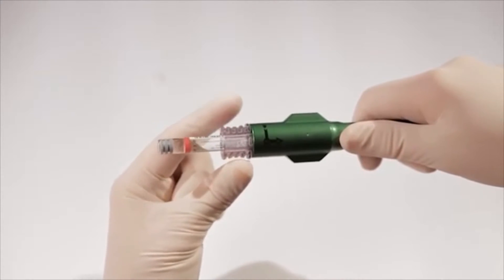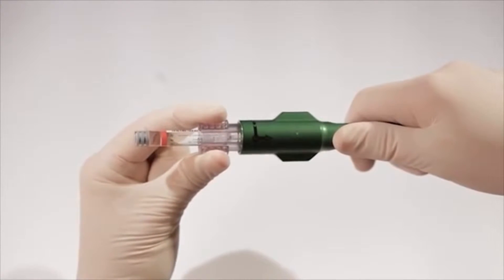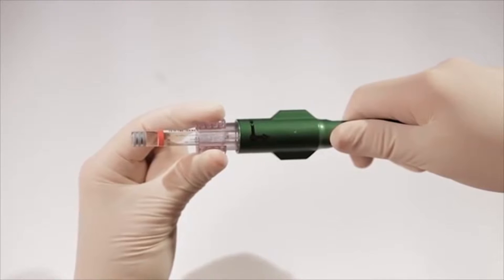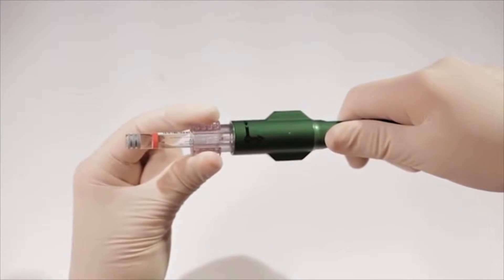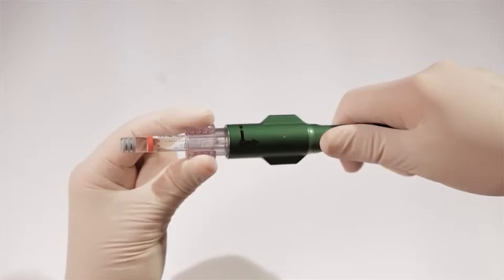To remove the 1.8-milliliter cartridge after mixing, first grasp the connector with your thumb and forefinger and pull straight out approximately one quarter inch to the number two position. Note that in the number two position, the 1.8-milliliter cartridge is still locked in the cartridge connector.